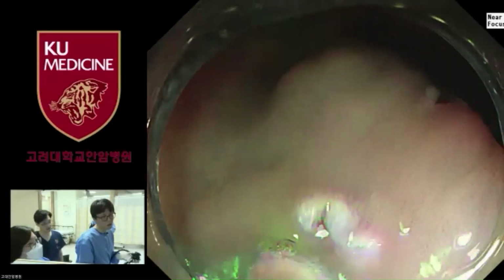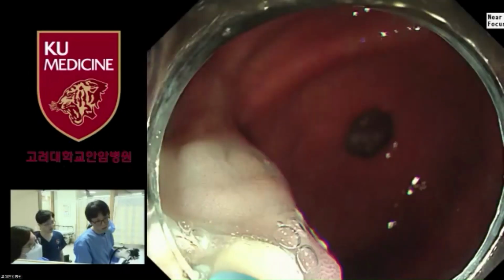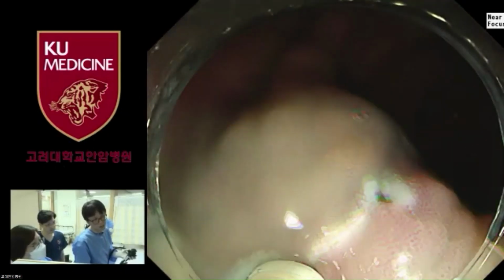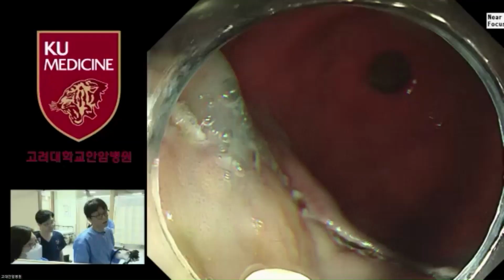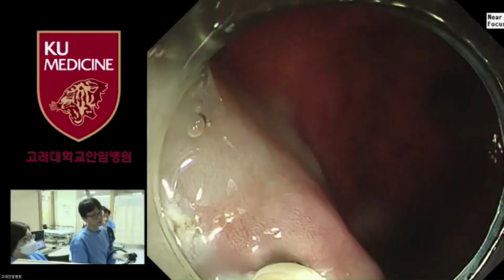So probably you do all the incision first and then you put in the robot. Yes, actually it depends on the location of the lesion, but today we are going to use the robot-assisted ESD. So we are going to make the incision all the way around the lesion. What knife are you using now? Now I'm using the Dual Knife J made by Olympus.